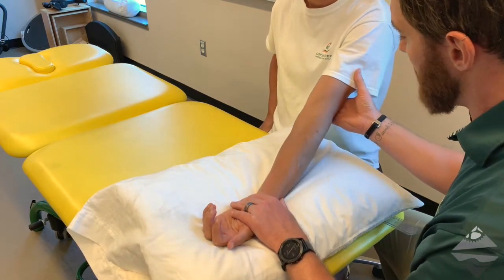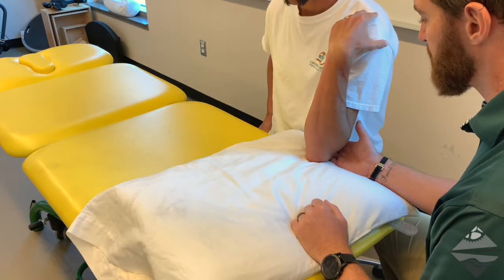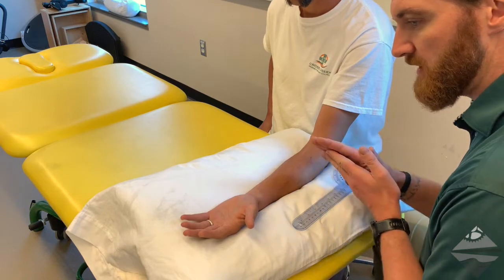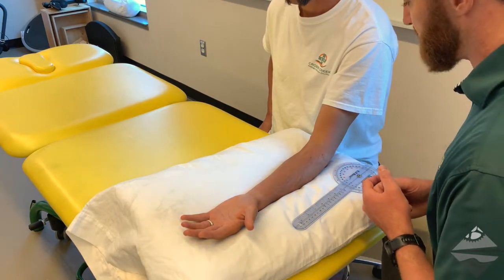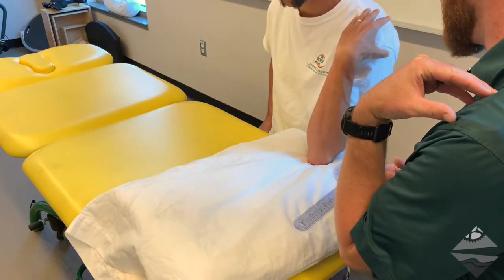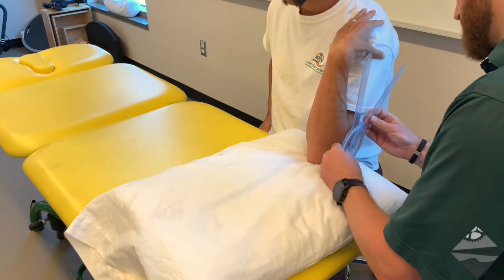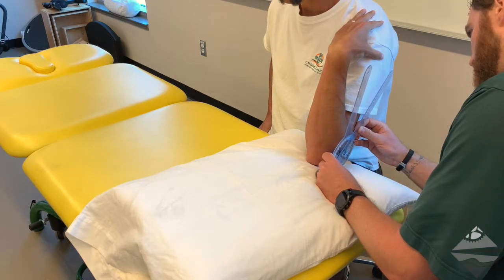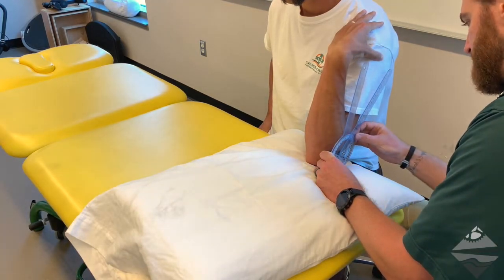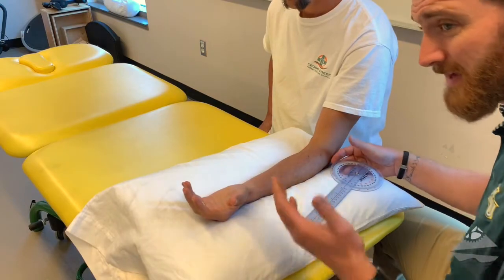First, make sure they have full elbow extension, then have the individual come up and touch their shoulder with their fingers for full elbow flexion. We can provide overpressure at that point looking at end feels, as well as any provocation of symptoms. For the goniometric measurement: the stationary arm is in line with the humerus, axis of rotation is in line with the lateral epicondyle, and the mobile arm targets the radial styloid process. That gives us about 144 degrees of elbow flexion — that's an active measurement.